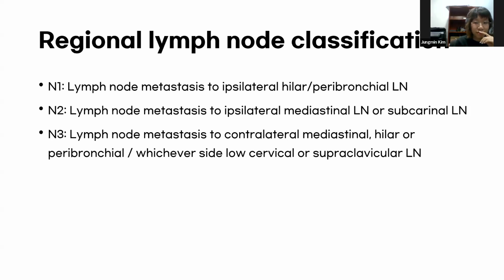I think that's the most important thing. Just look at it and see what's off, what's a bit enlarged, asymmetric, something's off, and you don't want to miss that lymph node enlargement as a doctor if you see a CT.